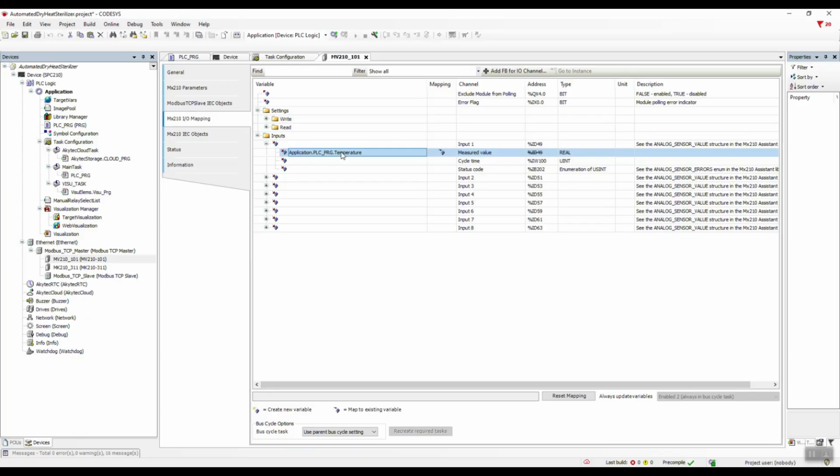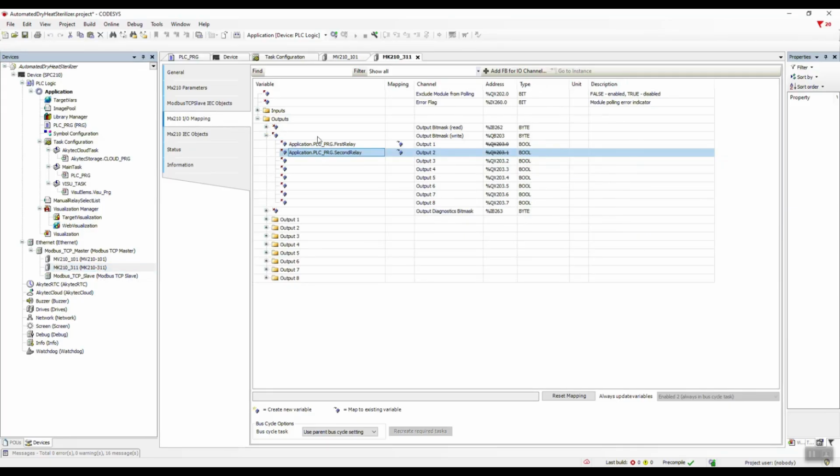Now let's add the template for the MK210311 digital input-output module. We'll link variables to its first and second relay outputs that correspond to the state of the first and second relays, which we'll use to turn the heater on or off. And this whole process takes us less than a minute thanks to the ready-made template developed by akYtec.